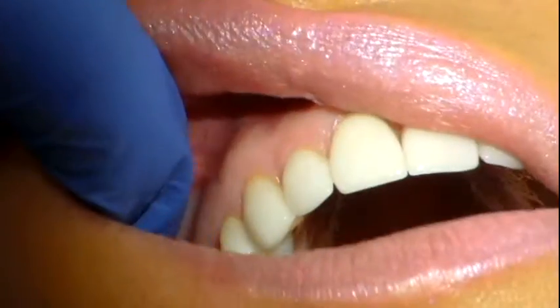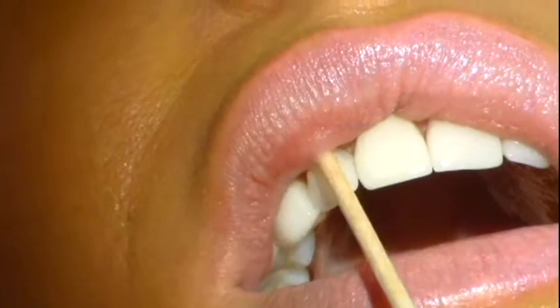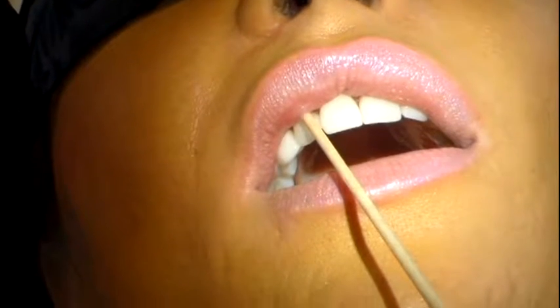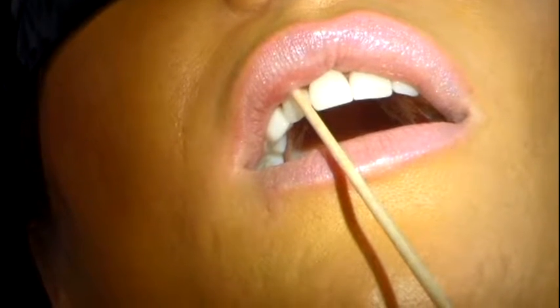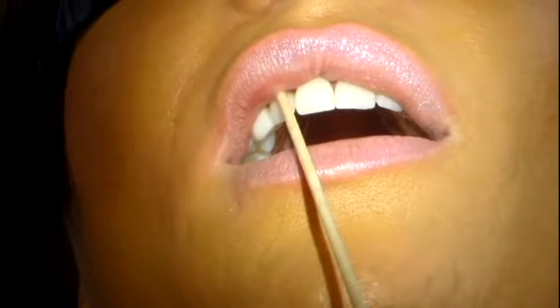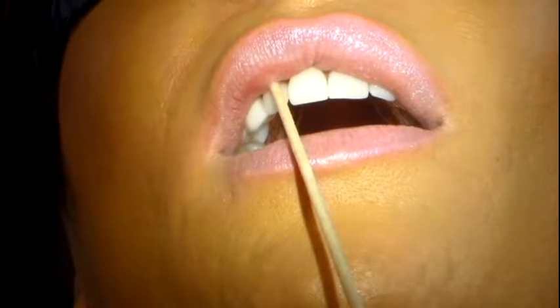The area's been debrided. We're going to apply the topical and let it sit for a minute. The ASA gets the canine, the lateral, and the central on the side of injection, with a little bit of fade out at the very center because the next nerve is taking over — there's a little crossover right at the mesial of the central on that side. It's going to get the pulpal tissues of the canine, the lateral, and the central, the overlying bone on the facial side, the gingiva on the facial side, and the lip.